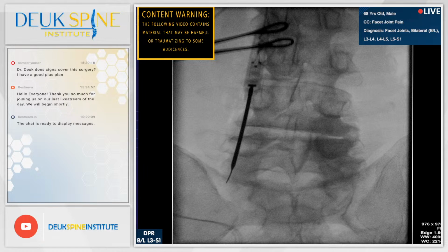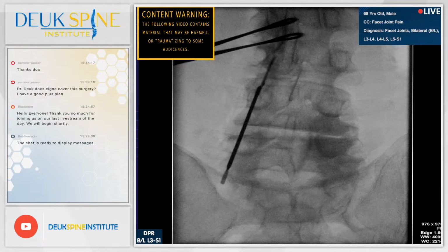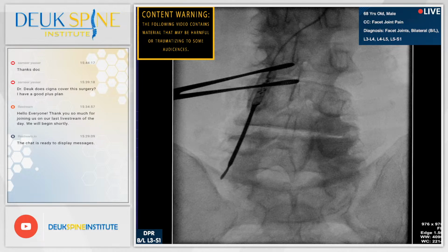I'm very happy with the position. Could be a little bit more north. I mean, I can't imagine getting better than that. That's pretty darn good. Yeah, I think we need it. Yeah. Go ahead and prep it.